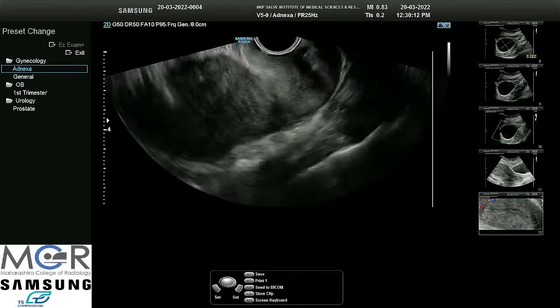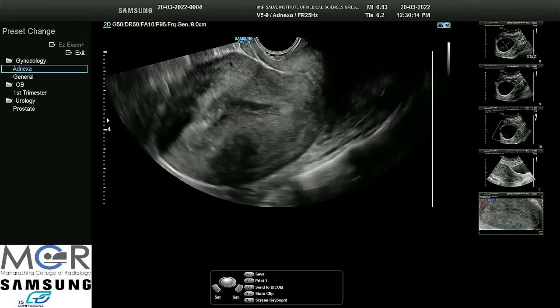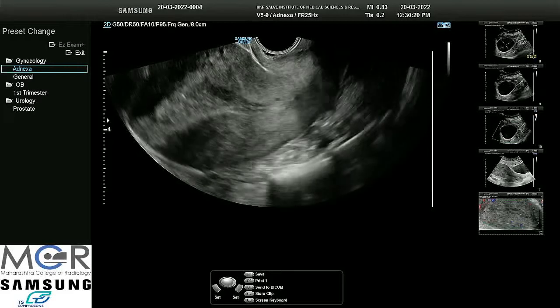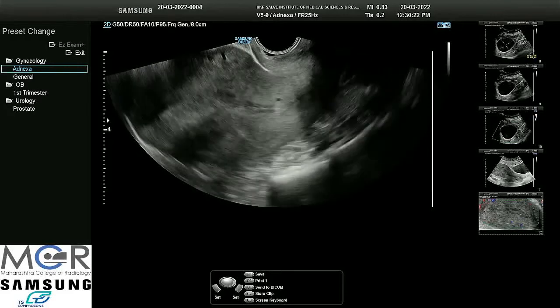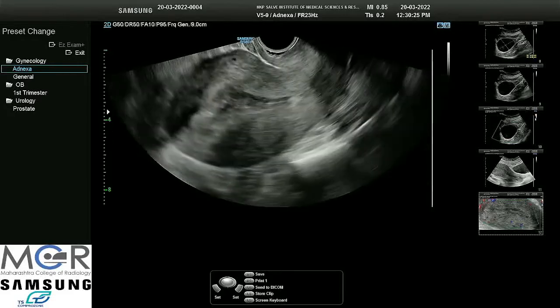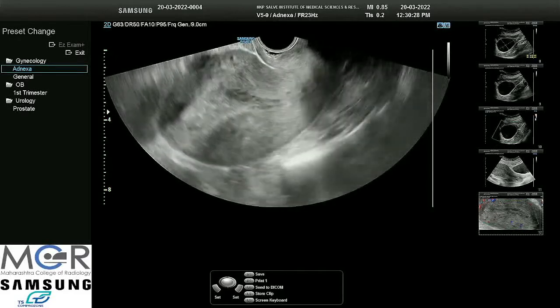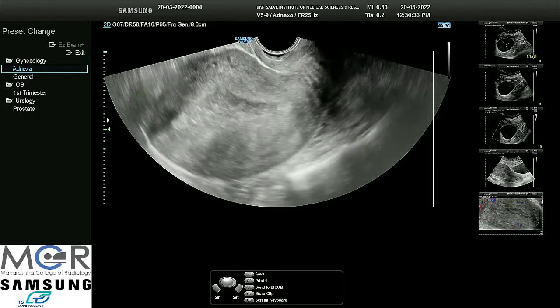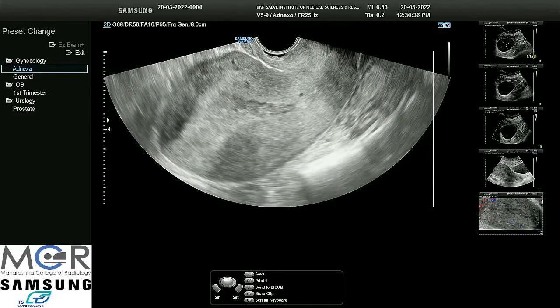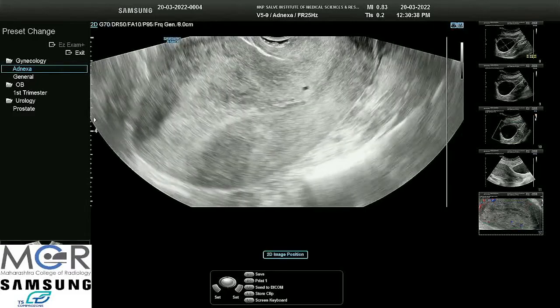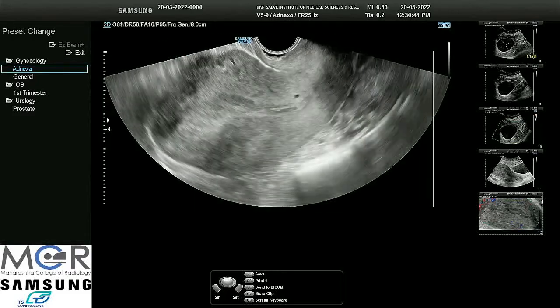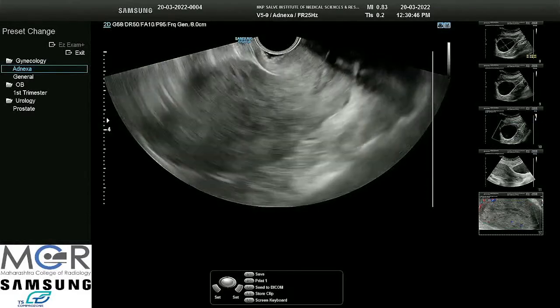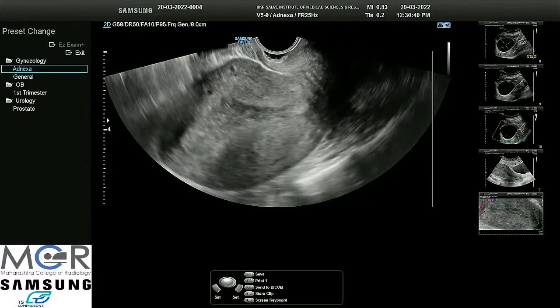Ultrasonography for further evaluation. Here we are able to see an anteverted uterus. Just see the myometrial echo complex — it is non-uniform, it is a heterogeneous type. And just see how the endo-myometrial junction appears.